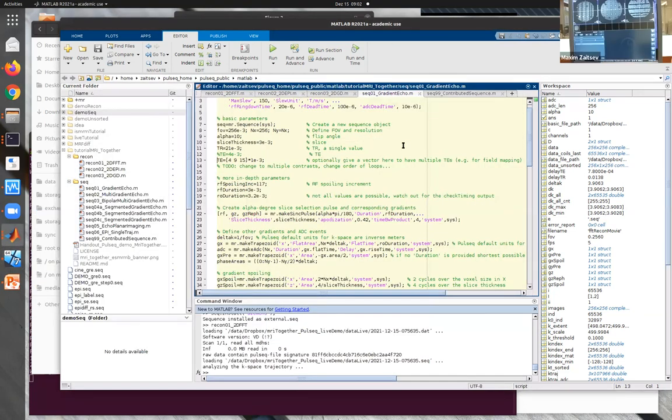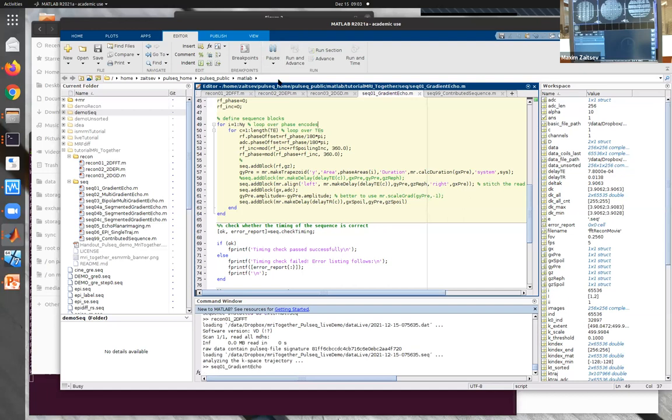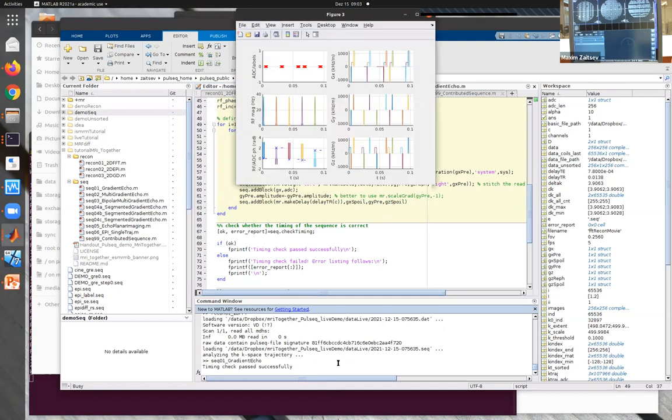Good. So I would say at this point, I will show you a few more examples. We run the sequence again, but now we use the array of TEs. This is implemented such that in the sequence we have an inner loop, which loops through the TEs and shifts the gradients a tiny bit around to achieve different TEs. And if we generate the sequence, it runs the entire script again, including the check. That actually makes it slow. We didn't need the check.